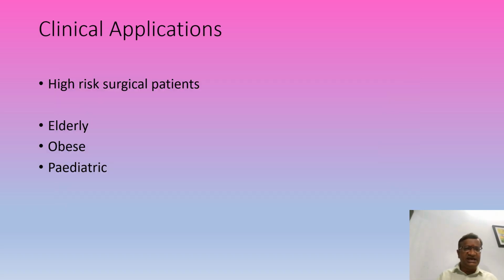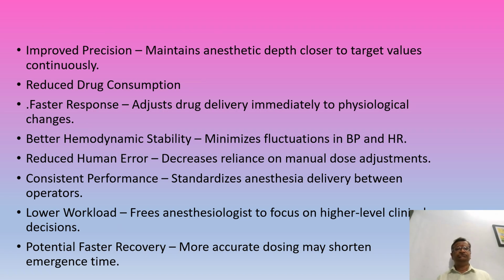Yes, the clinical applications are high risk surgicals, elderly, obese, pediatrics, so many patients we can have. Now, what is the use? Why do you want closed loop? Improved precision. Yes, we are at 1.2 MAC.